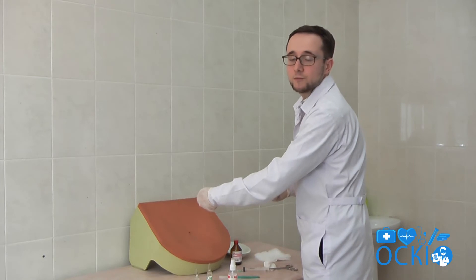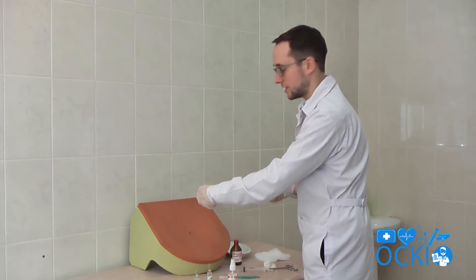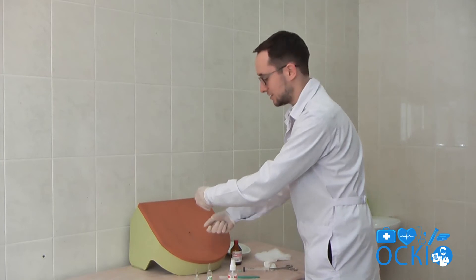Pierce the abdominal wall by trocar. Remove the stylet.